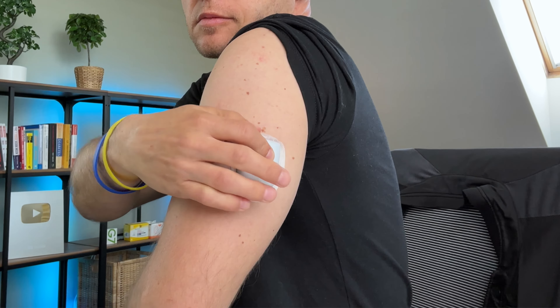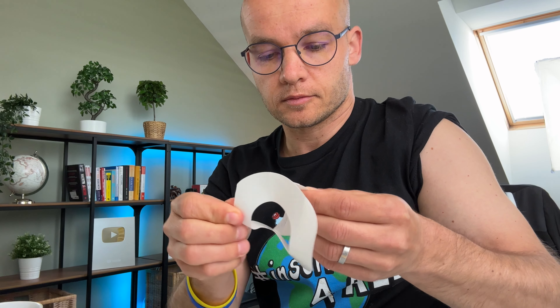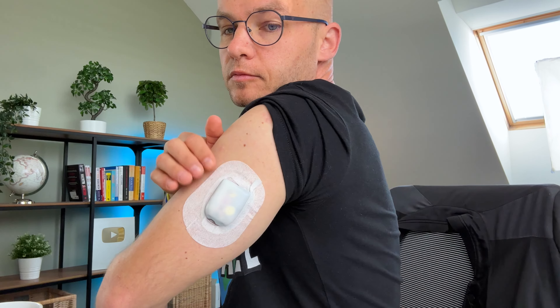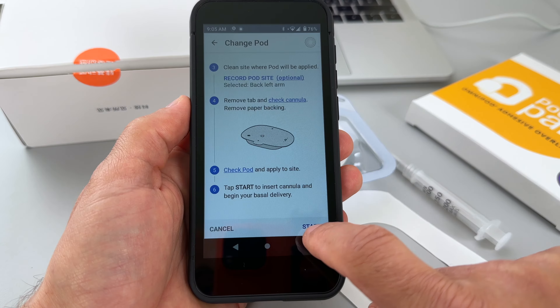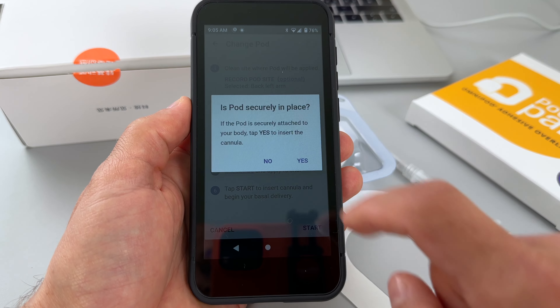Hit next — the pod will start priming and you will hear it clicking. It will click about 20 times and once you hear that sound it is ready to be applied. Now I can clean the site. One cool feature of Omnipod is that you can record the site where you are applying the pod. I'm putting it on my upper left arm, so I'll choose that and record it on the controller. When I do my next site change, the system will show me the history of previous sites to help me rotate regularly.